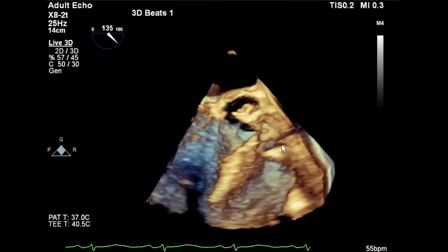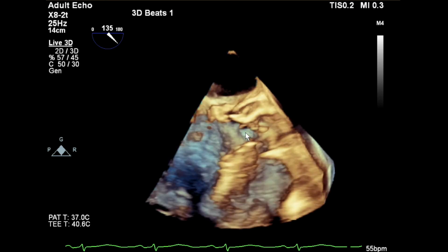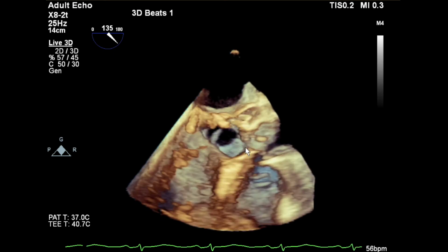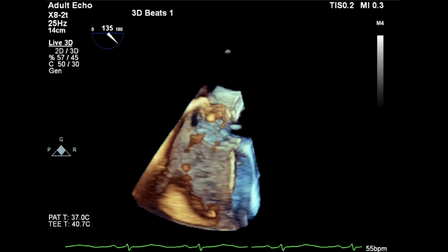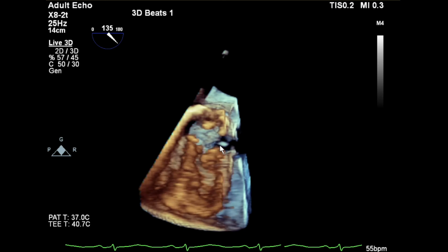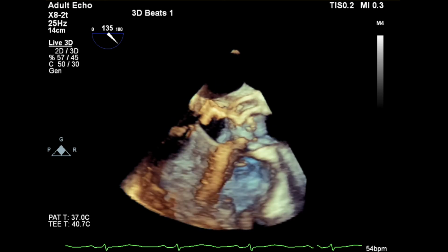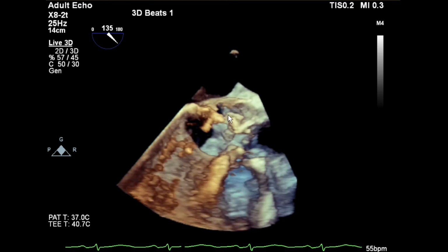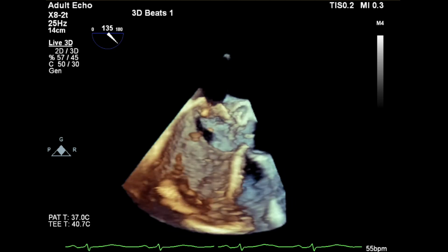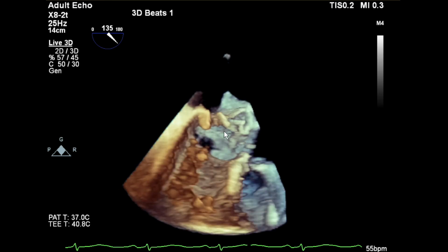So you can see, here's the aortic root. AVR here. You can see that bit of suture flicking about just under there. So I'm going to move the picture a little bit. What's amazing is, as you see the valve here, if we look at it face on, if I rotate it a little bit like that, you can see where the sewing ring of the AVR is here. And what's interesting is it's essentially broken away from the patch here. Behind it, you can see that this patch has this blind ending region, but actually it's quite extensive. It carries on around behind.